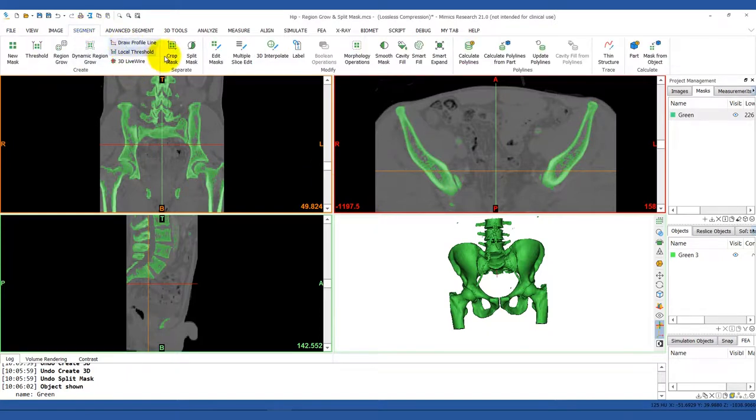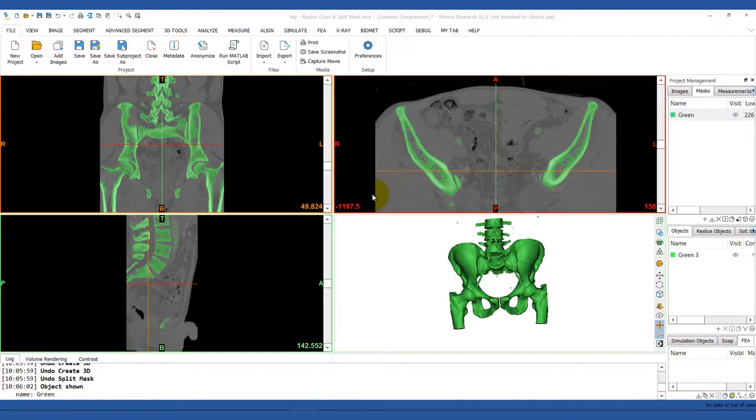We're going to go over the split mask tool. If you want to separate two structures that are connected, this tool allows you to mark the regions that you want to split off.